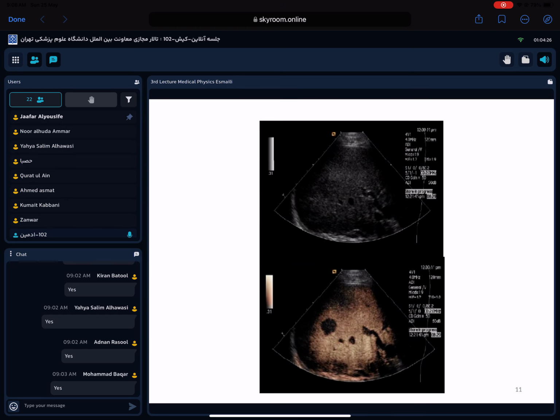you know that in diagnostic radiology, I'm sure before me, my colleagues taught you that in PET scan, in computed tomography, and in other kinds of radiology imaging, you can use some specific drugs which can increase the contrast of the image, and we call them dye.